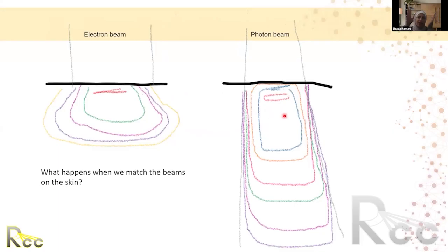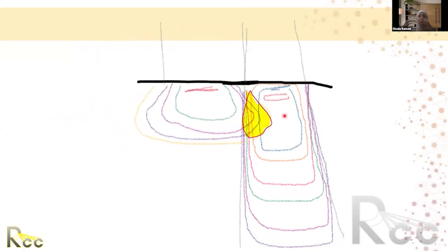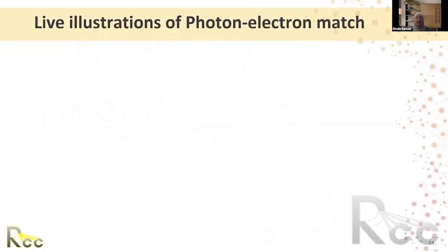Okay, so we will use 6 by 6 or 10 by 10, we'll put this block here, and then what's the monitor unit we need? So you see them separate. And again, this is a natural progression of things. You use the planning system for photons and you keep electrons separate. And then slowly, you start adding both of them. But once you start adding them, it becomes uncomfortable because now you are seeing the hotspot, and now you have to take action. Well, the hotspot has always been there, right? We just haven't seen it before.